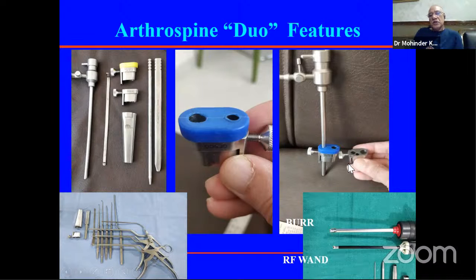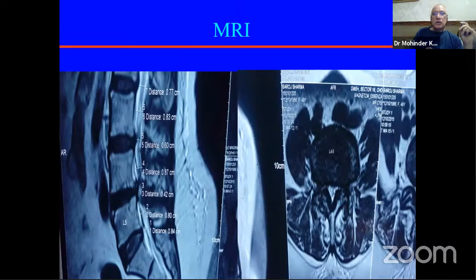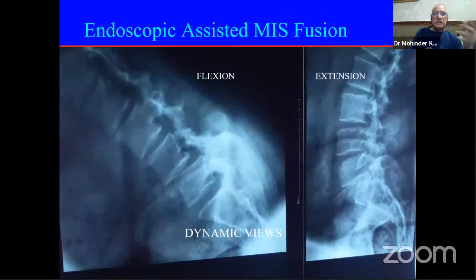In dry scopy, the principles remain the same as the Destandau technique. And when you are using saline, you follow the principles of PSLD. So this is to be understood. And this is a miniature Destandau system. Like we change car models, mobile models, so this is a little more miniature system.